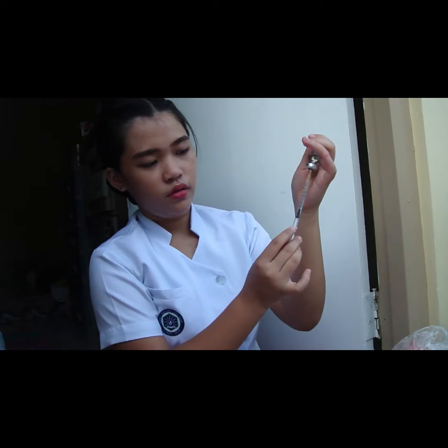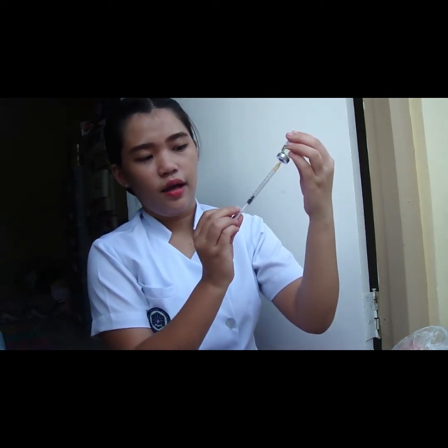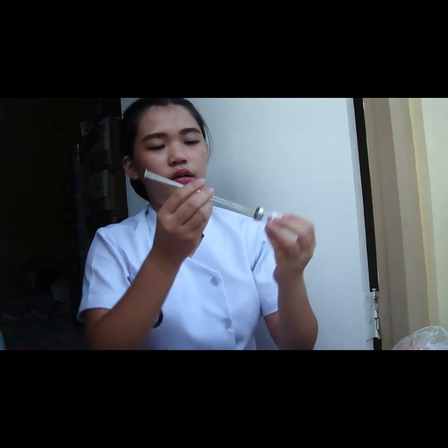So, pabalik natin yung syringe and kunin natin yung right amount ng medication.